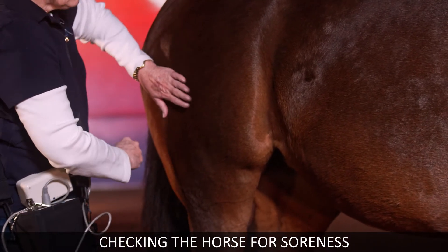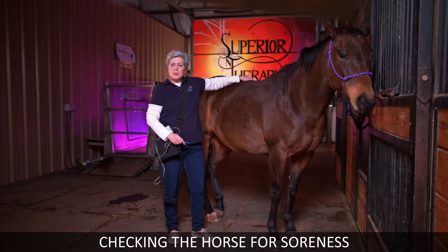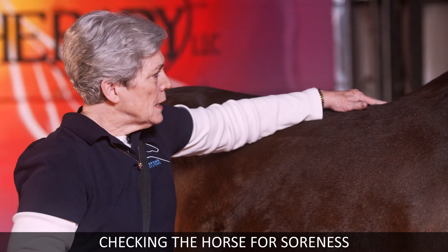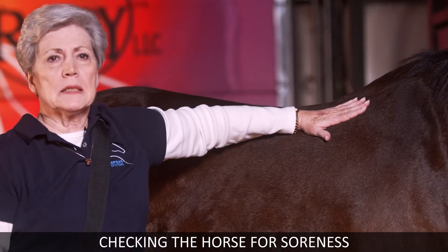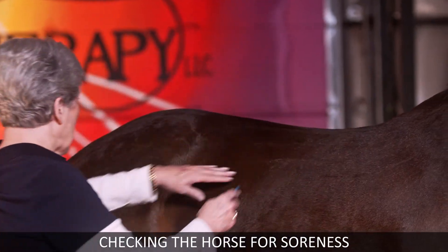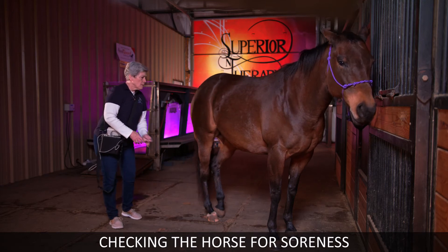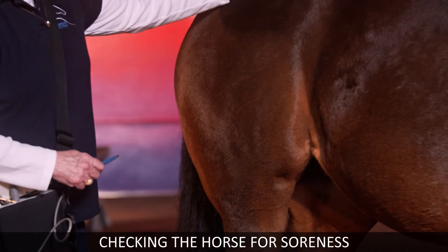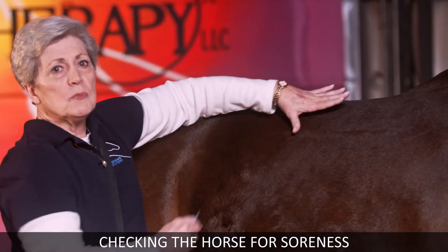When you're doing the back, press hard going down the backbone, but do not use your fingernail or anything with a ridge to it. If they've got a problem on the back, they will drop. Anytime you find a problem in any of these places, treat it and then go back and check it again the exact same way. Be sure to get down the hamstring — they may not move here, but they'll flinch there. After treatment, there should be no movement when you recheck.